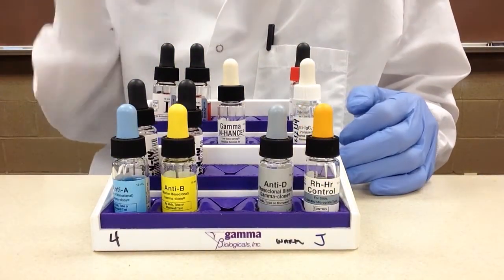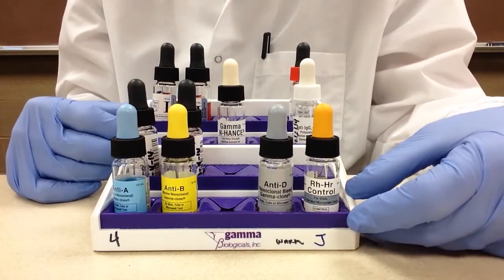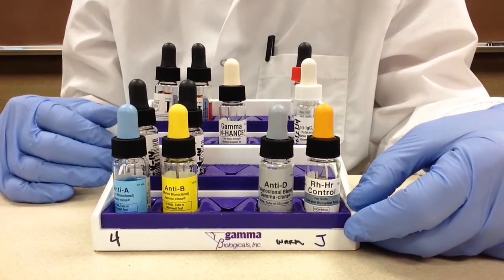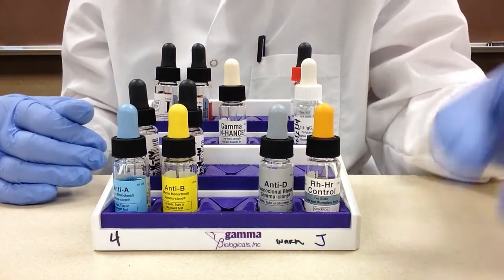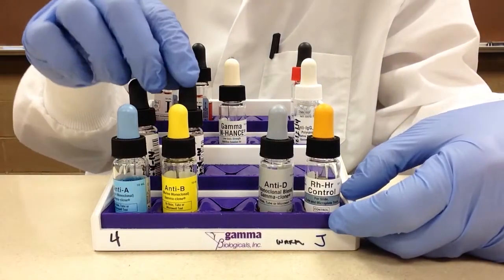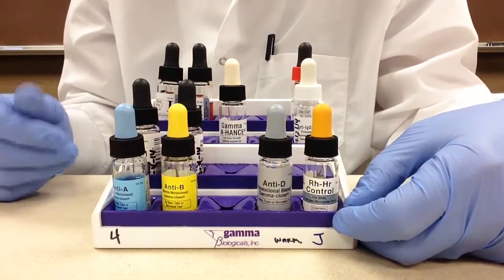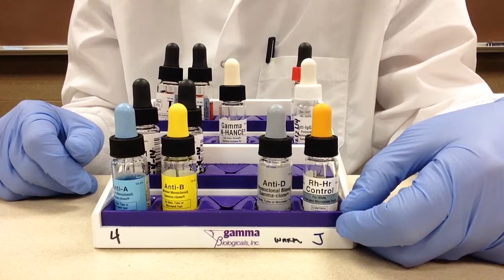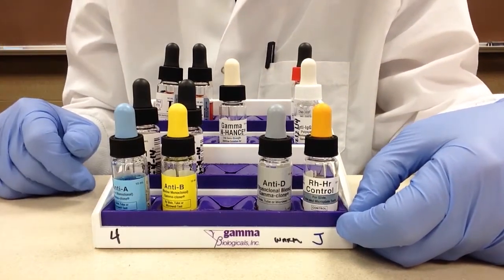When it comes to pipetting reagents, the rule in blood bank is that you always pipet clear reagents or liquids first. The basic idea is that you are combining plasma, serum, or anti-serum with patient cells or reagent cells. It's very important to pipet clear liquids first because if you pipet cells first, it's hard to tell if you've added the other reagent or liquid.